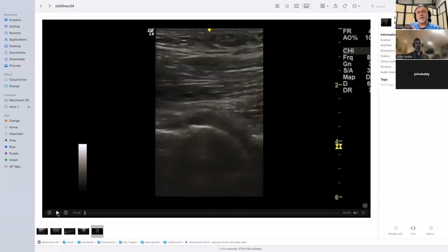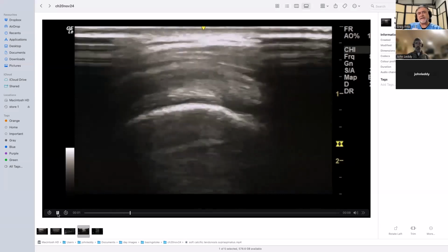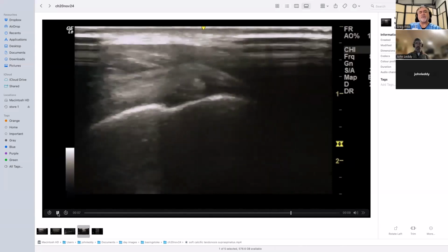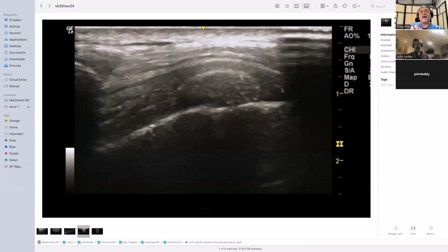So go back one more time, really quick. Let me ask you this: the fibers of the supraspinatus that are coming out from under the acromion, in that one that you stopped back there a ways, where we saw the actual structure. Yeah, there. When we see the acromion on the left, and the fibers are coming out from under the acromion and coming down around to the facets and to the enthesis. Can you tell me, do you feel that this mass is basically, we're visualizing it around the collagen strands? Because this is not displacing it like a balloon that was blown up in the tendon. These fibers are going... I think it is.